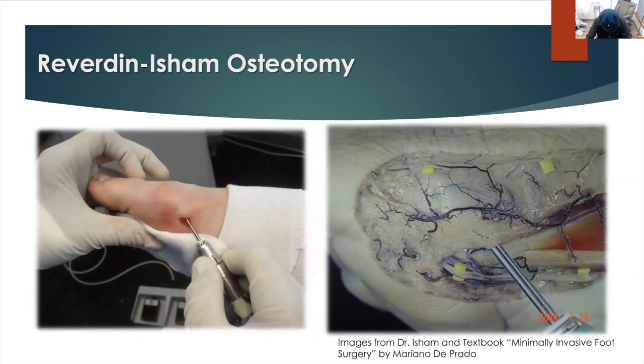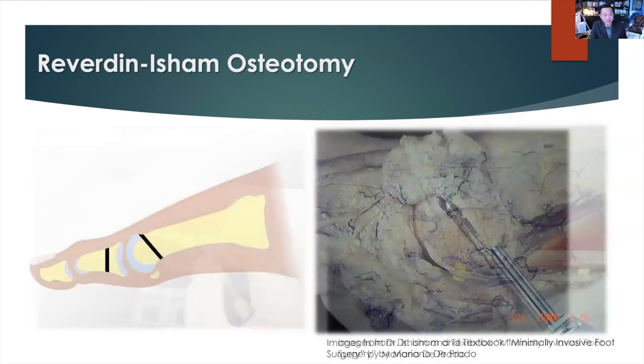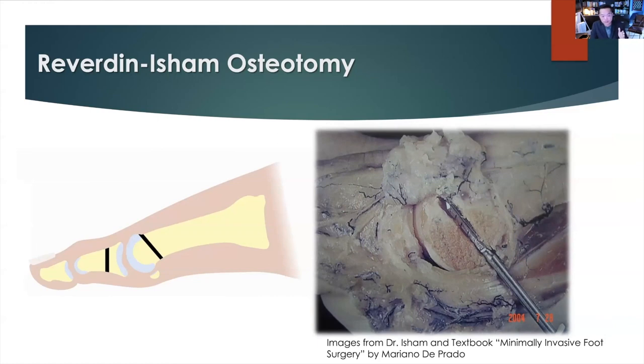That's right. And next, this demonstrates the shaving off with a 3.1 burr. And then here's what Dr. Isham earlier described as the DD, dorsal distal, right below, proximal to the cartilage, and then proximal plantar. That angulated wedge osteotomy corrects the PASA angle and compresses the osteotomy when patients weight bear. What I found also is that because of that angulation, it derotates the head because of the medial wedge, and sesamoid position gets improved. And then there is the typical Akin procedure here. It demonstrates the DD2PP, dorsal distal to proximal plantar angle of the osteotomy.